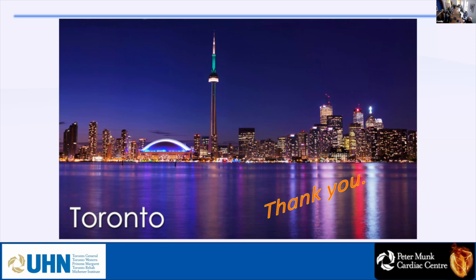So these are like the dream team that we have known in Toronto. During my training, I'd heard about this dream team and I kept running into all their work. I don't know if there are enough sonographers around here, but when I first arrived, on the echo machine that we push down for the intraoperative TE, there was always a card with Dr. Omran's diagram of the mitral valve mapping. So we used to have to cheat: is that A1, P1, A2, P2, A3, P3? So that's where it came from. So yes, we do have a legend with us today.